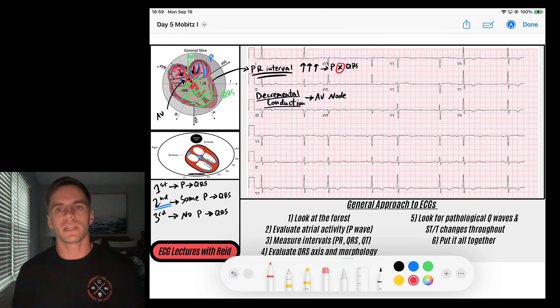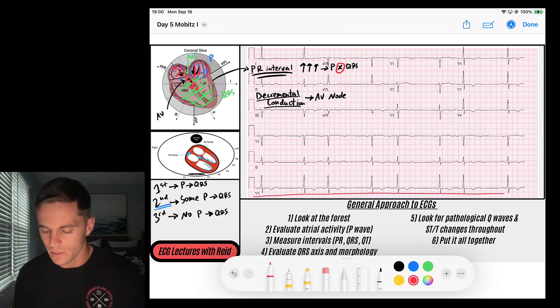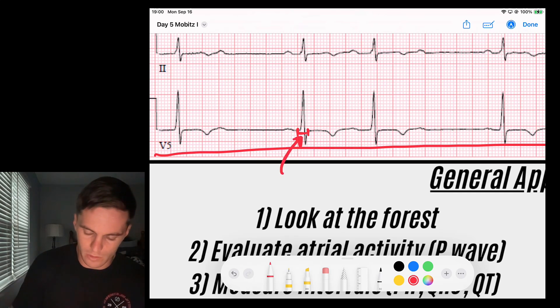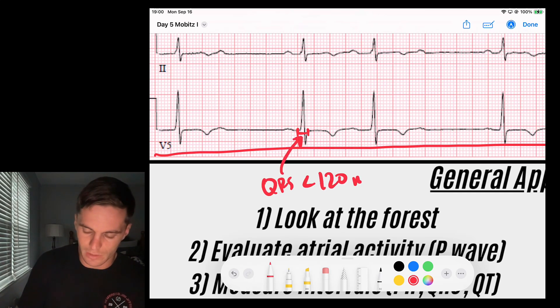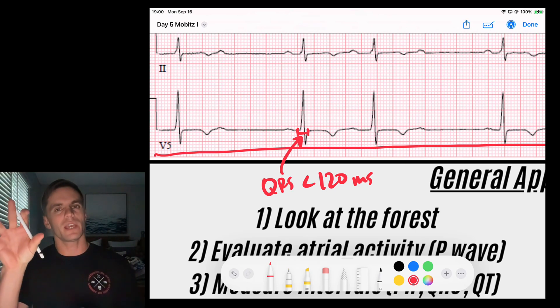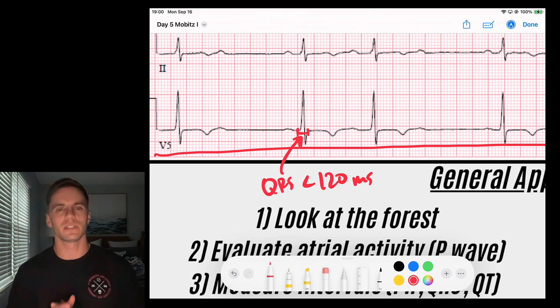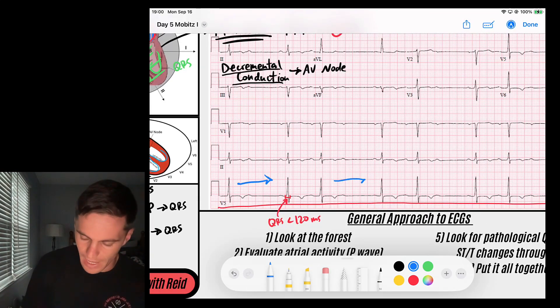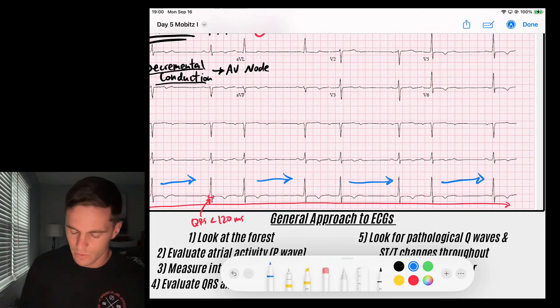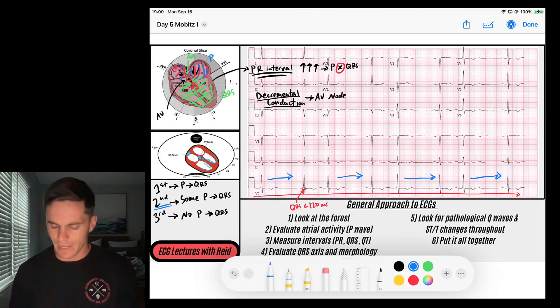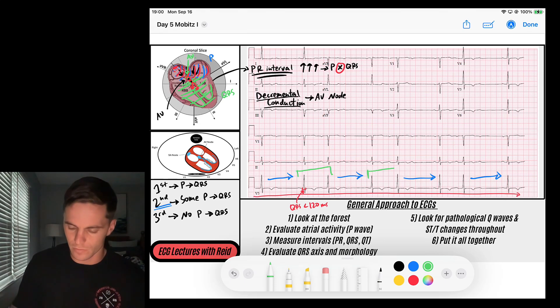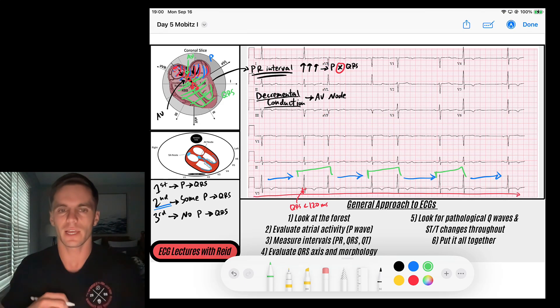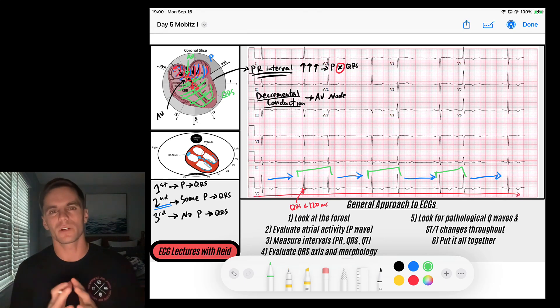Looking at this EKG, the first thing I notice is a narrow complex QRS — duration less than 120 milliseconds — telling me the QRS is generated by a signal coming from the AV junction down the His-Purkinje fibers, rapidly depolarizing the ventricles. I also notice gaps where there's no QRS, lots of pauses. In fact, I see groups of QRS complexes — groups of two, groups of two — that's called group beating.